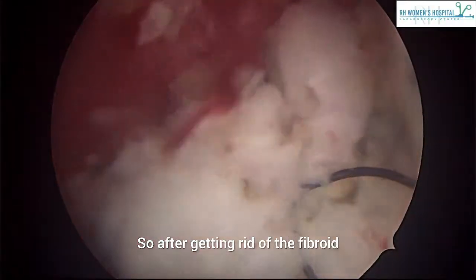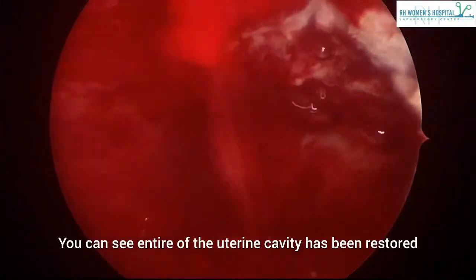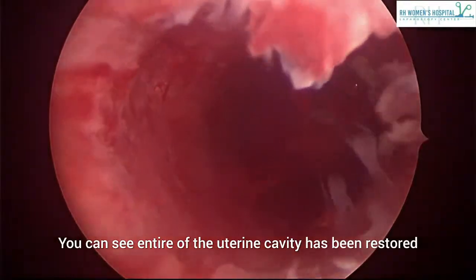So after getting rid of the fibroid, this is the final picture. You can see the entire uterine cavity has been restored.